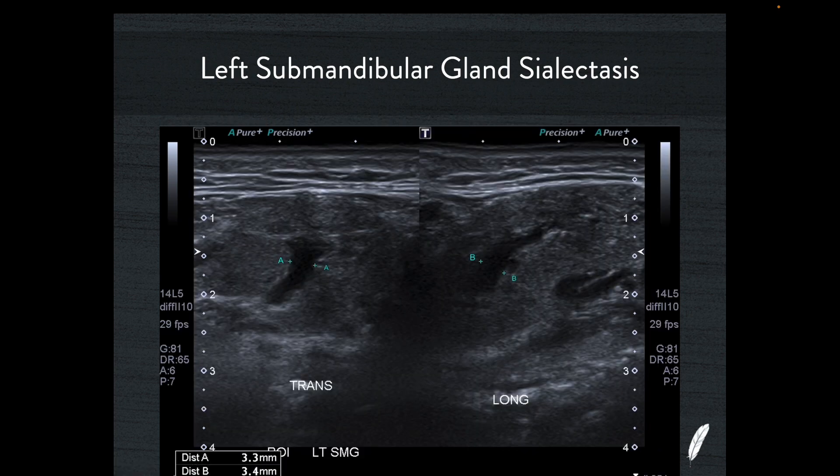Looking more closely — analogous to going to the pelvic-ureteric junction in a kidney — you can see there is a bit more of a distended tube here, and we can see clearly there's sialectasis in this gland.